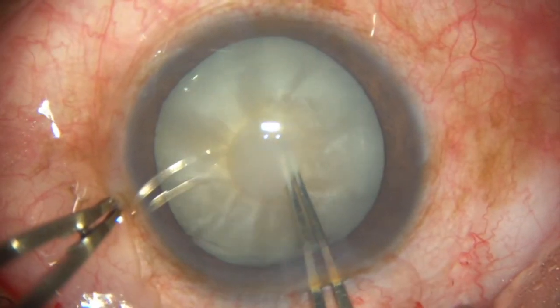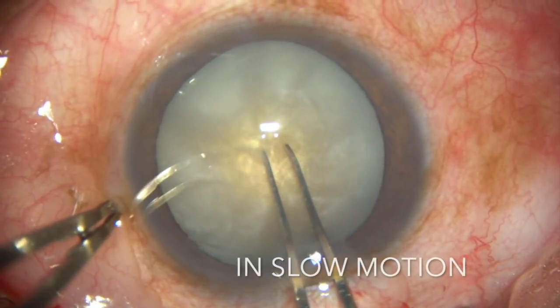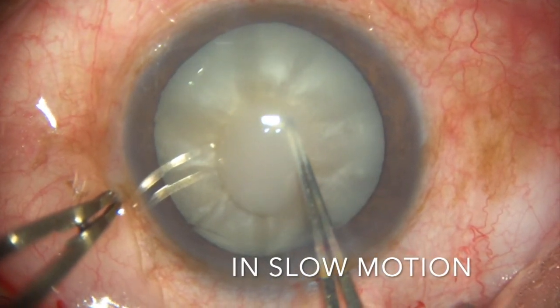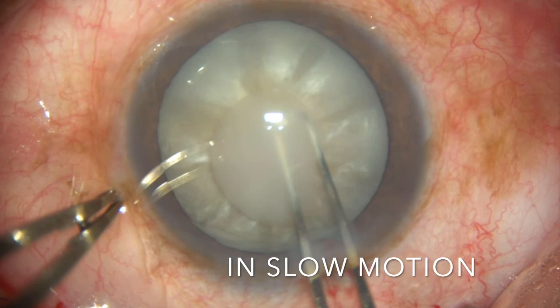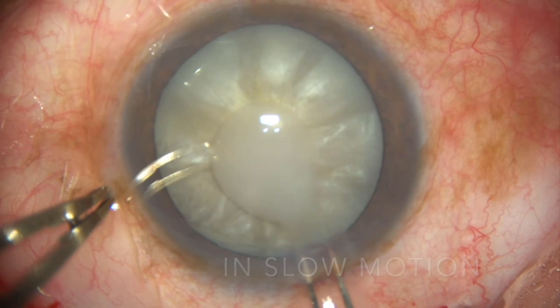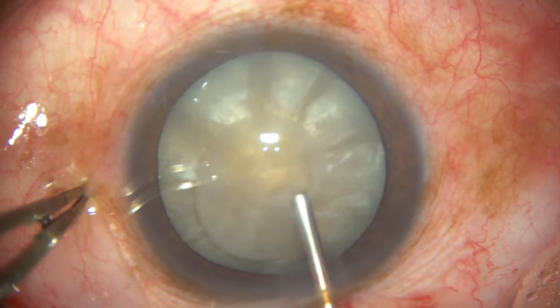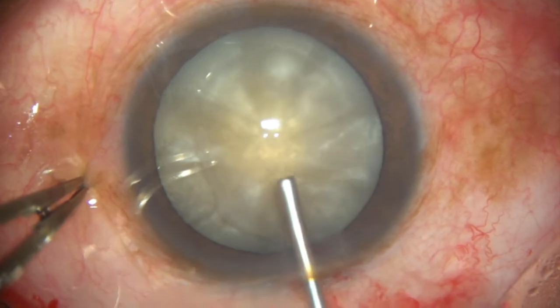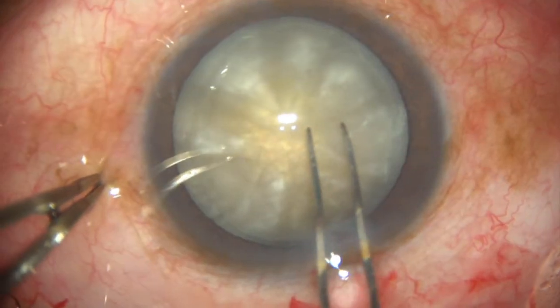In the next case, the moment the anterior capsule is pinched and the flap lifted, there is liquefied cortex that oozes out. Because of the flap, the liquefied cortex comes out in a controlled flow. With gentle maneuvering, liquefied cortex is gradually replaced with viscoelastic. The capsule flap is again lifted, and with the Utrata forceps, continuous rhexis is completed.